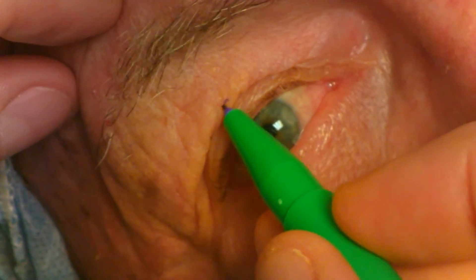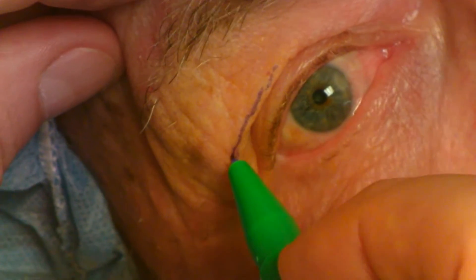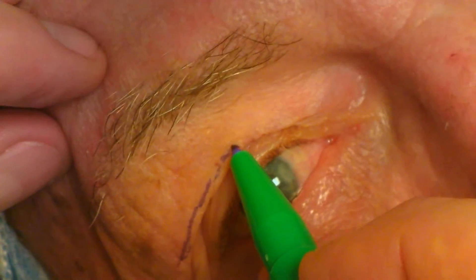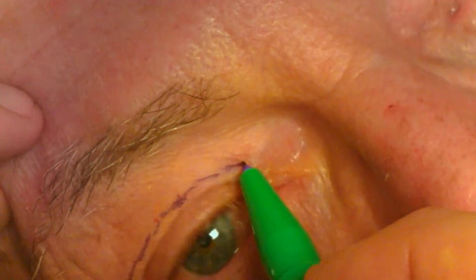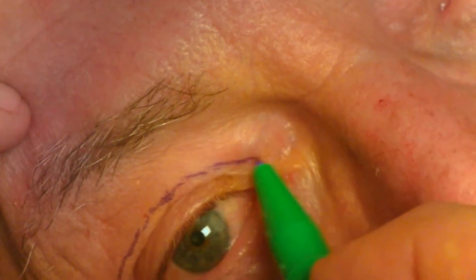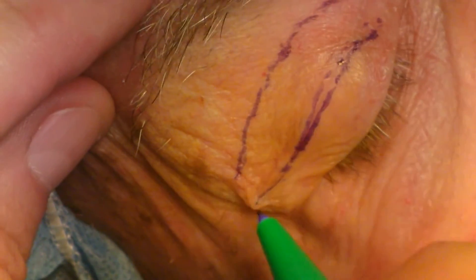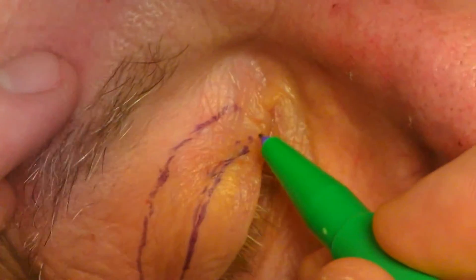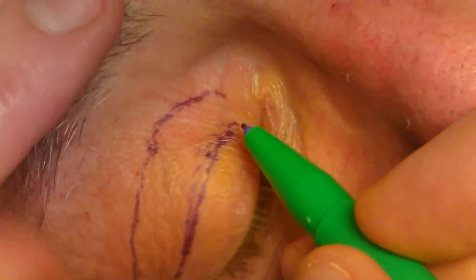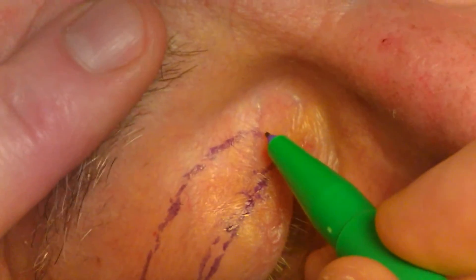The redundant skin is then marked. There are multiple ways to do this. Currently, I mark the skinfold at the level where it rests just above the lid crease marking with the patient looking straight ahead. This extends from the level of the punctum medially and does not extend outside the lateral orbital brim laterally. The lateral lower marking is then connected to the upper marking with a gentle upslope. It can be difficult to mark the skin medially, and stretching it laterally allows marking.